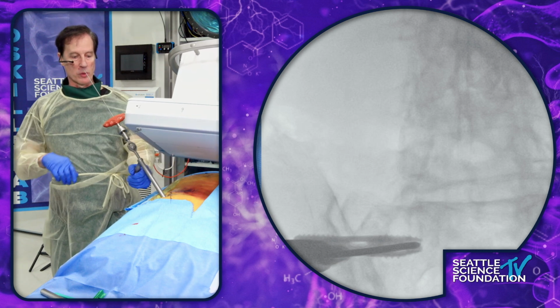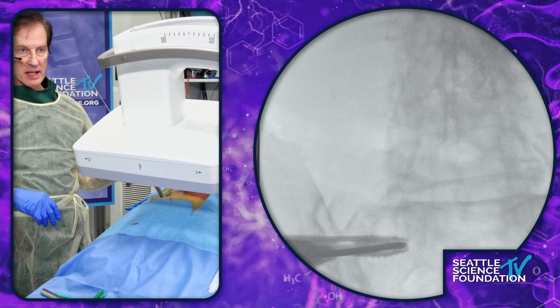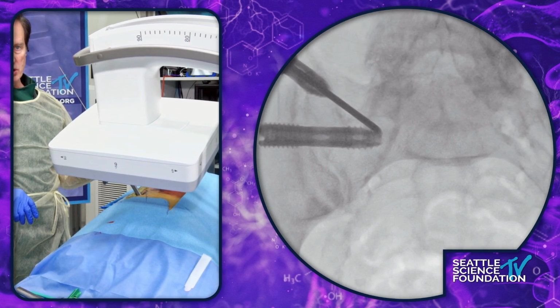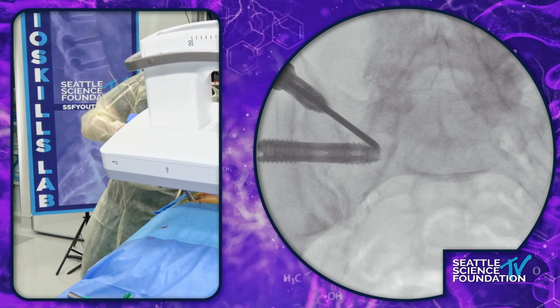Go back to the inlet view. We want to make sure the pin is not migrating on us. There is a lumbosacral trunk that runs along the anterior portion of the sacral ala that we need to make sure we do not target. That's a little bit more lateral than our distal tip of the screw.